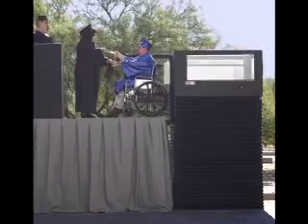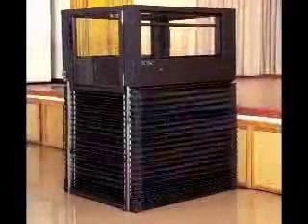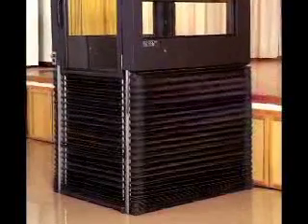Safety skirt. The entire underside of the lift is enclosed by a safety skirt, which prevents access to the operating components and entry to the area underneath the lift car.